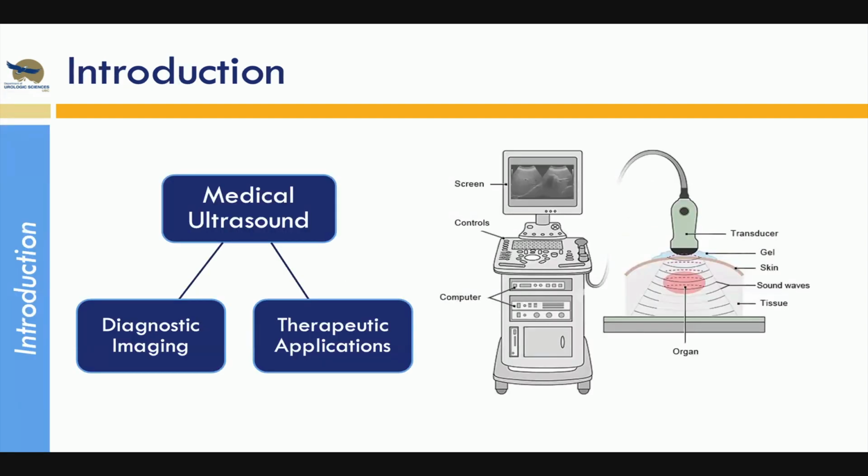So ultrasound is a very commonly used initial diagnostic imaging modality. It's a rapid modality that's effective, portable. The equipment is relatively inexpensive compared to other modalities, and it doesn't cause any harm to kidneys, doesn't cause any radiation, so it's quite beneficial that way. In addition to use as diagnostic imaging, ultrasound is also a great guidance tool for therapeutic applications for a number of urologic interventional procedures, such as HIFU, which I will talk about.